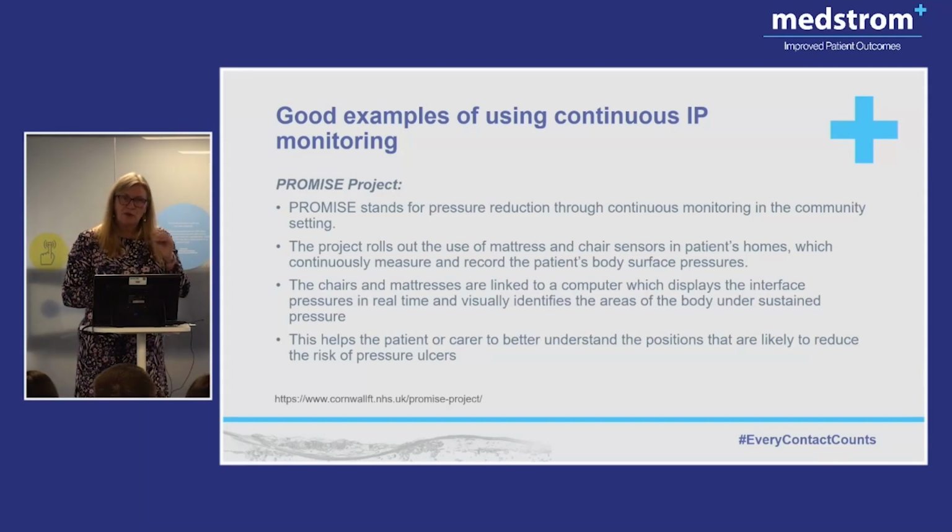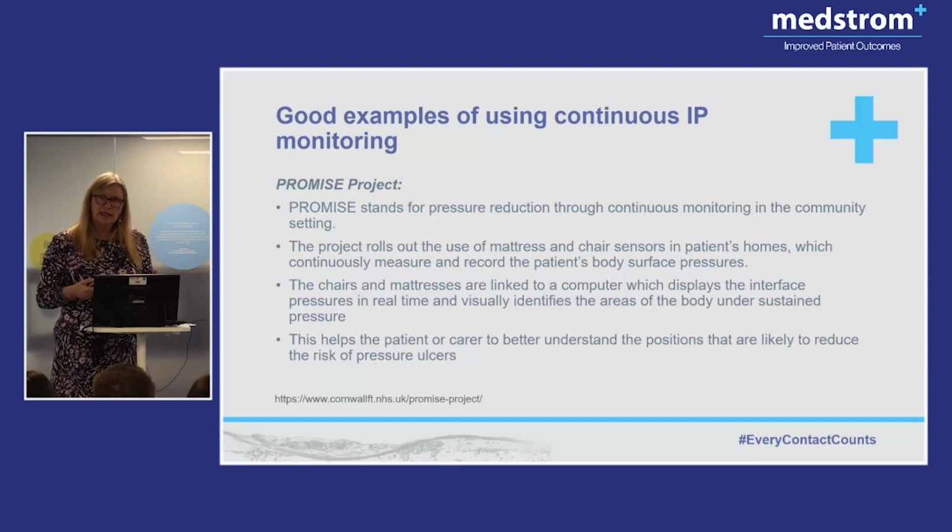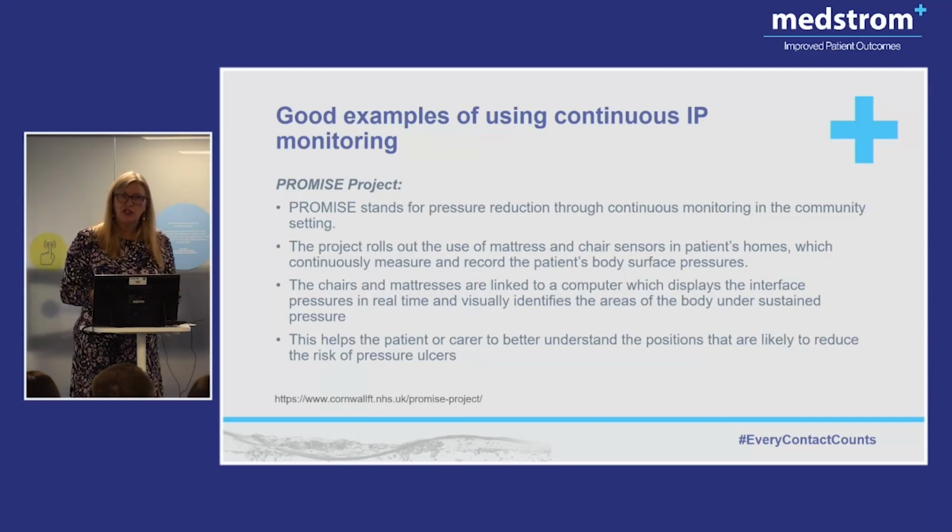So she worked with them with pressure mapping to show them what the equipment was doing for them, to work out if they tried a different mattress, whether actually that gave them a different profile. She didn't put it under them for 21 minutes, she put it under them for 48 hours. Think about when you go to bed. When you get into bed, are you in your comfy position? Or does it take you a good 10 minutes to settle into the mattress, get your best comfort?